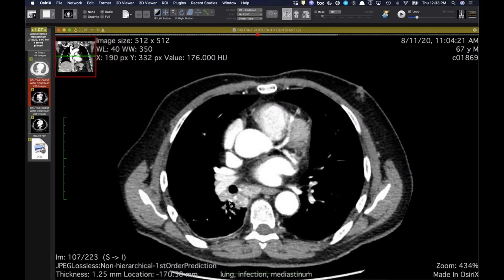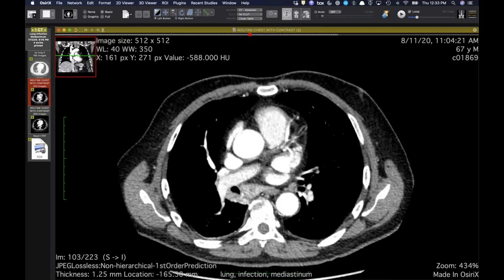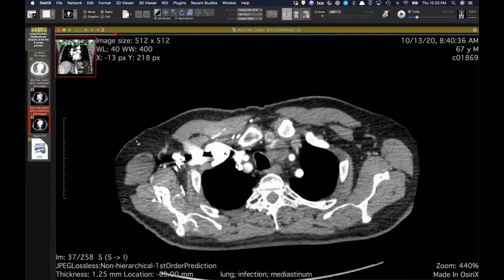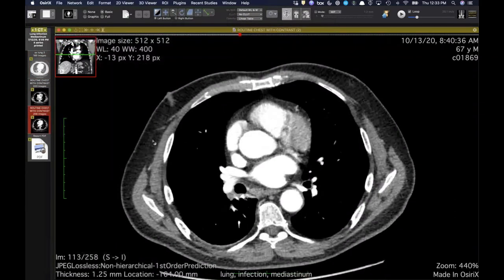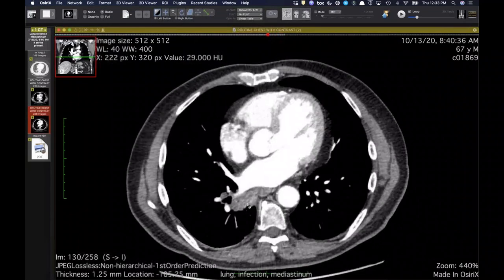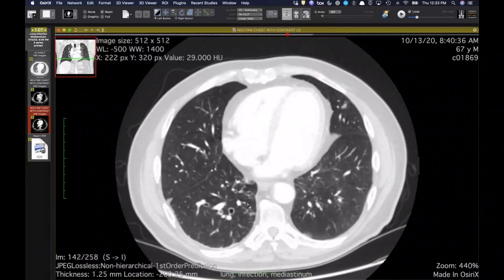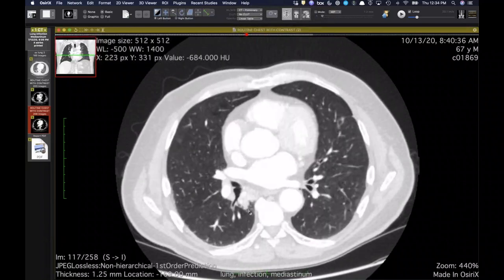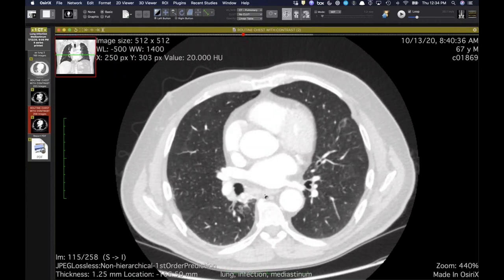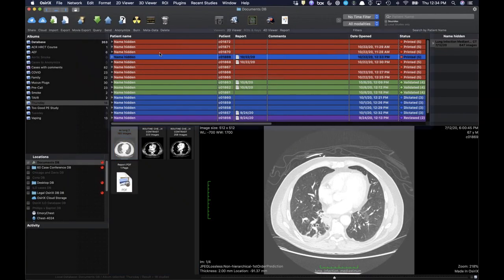And certainly it's not unreasonable to think this could be a cancer, as the lymph nodes are maybe a little hyperemic. But he started on fluconazole, and you can see this is 2 months later, things are getting better. They haven't completely gone away, but oftentimes we see residua of cocci that never do completely go away. So this is improved at this point. I've shown cocci that mimics lung cancer with bone lesions and everything. This was one that was a little bit of a surprise.